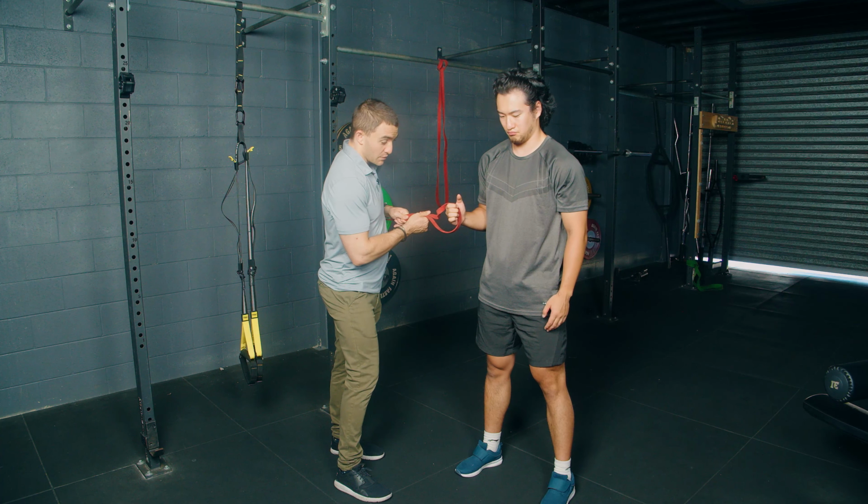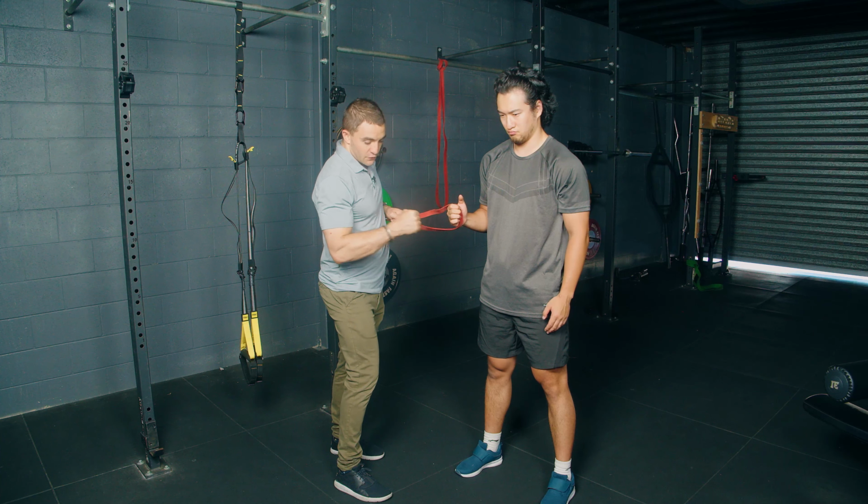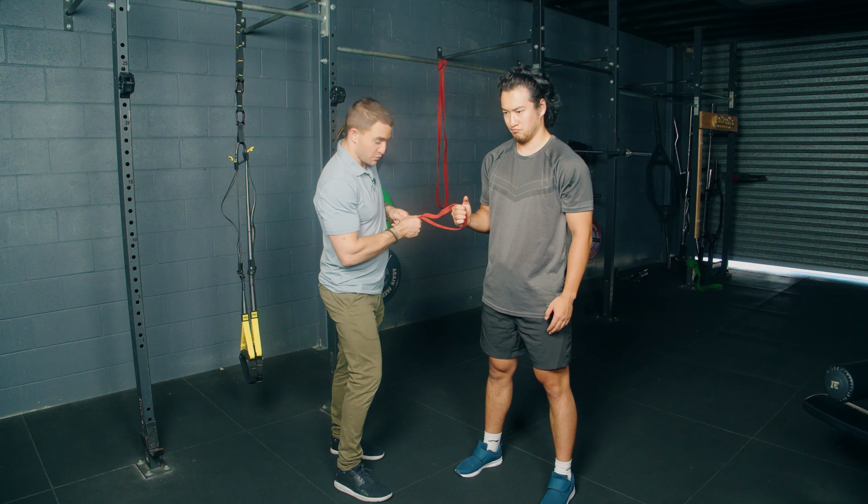Notice it's all gone. Now what I'm going to say to Cal is I want to keep that nice and steady. I don't want, when I let this go, for your arm to fly out. I want you to be able to apply force quickly. And I might count them down so it's predictable the first time. 3, 2, 1, go. Perfect.